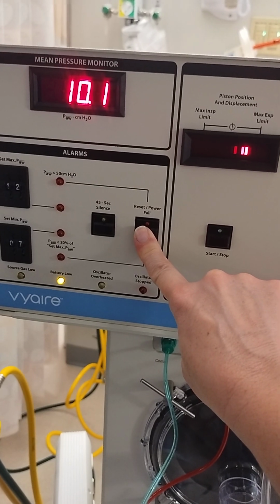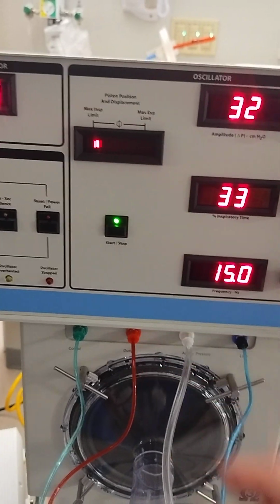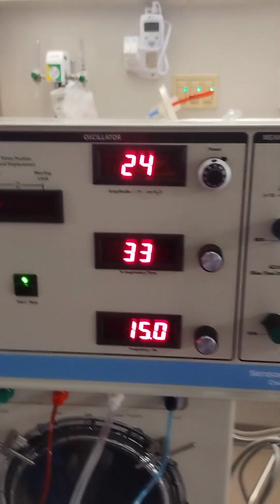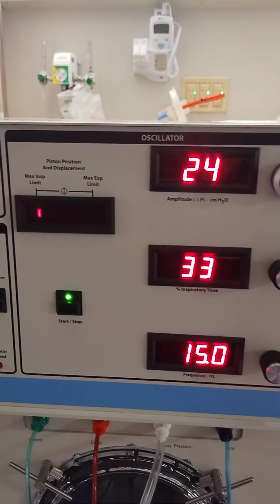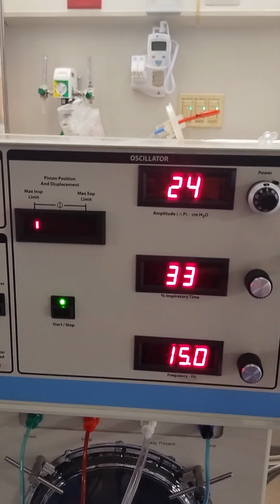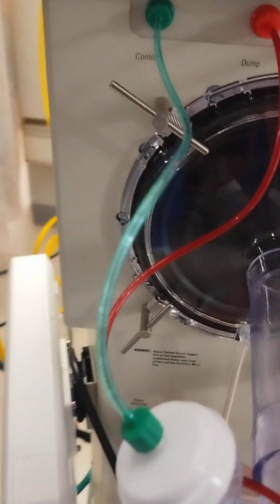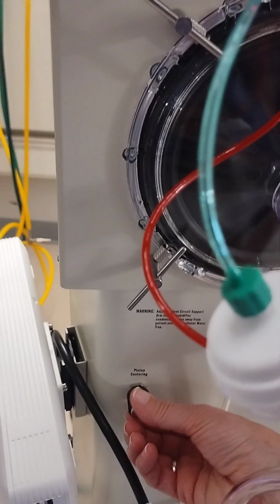So we're resetting. Now we're ready to start our oscillator, and we're going to adjust our amplitude to achieve wiggle between the nipple line and the umbilicus of the baby. And we're also going to center our piston. So let's center our piston.